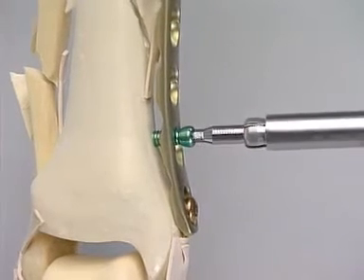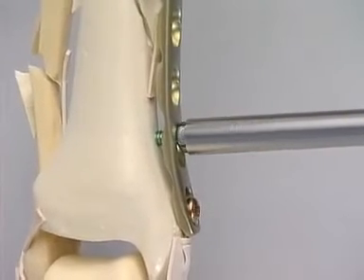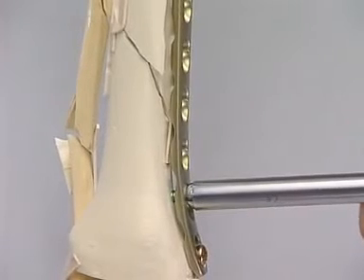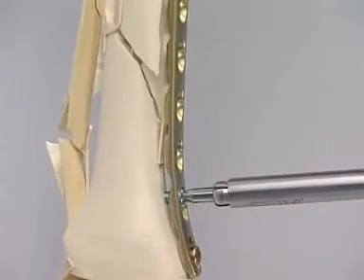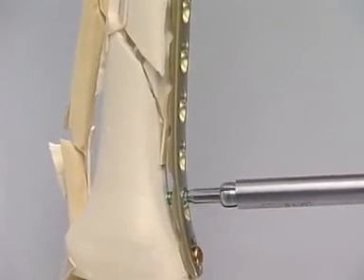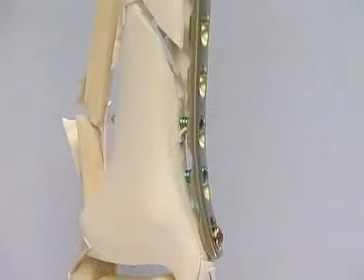If the LCP holding sleeve is fixed over the head of the screw, the bone fragment that is being held can be drawn a little farther onto the plate with this sleeve. Whether this is necessary depends on the position of the fragments. After withdrawal of the LCP holding sleeve, the green locking head screws are finally firmly tightened. After identical pre-drilling, a further green locking head screw is inserted through the third hole in the distal end of the plate.